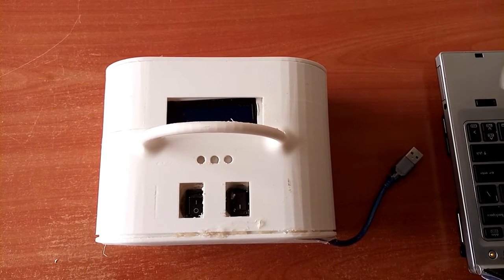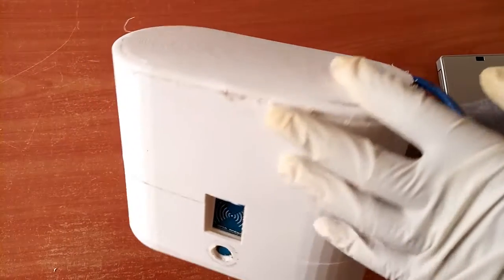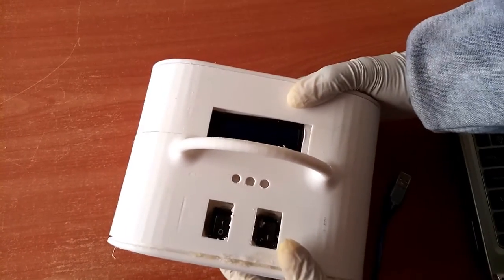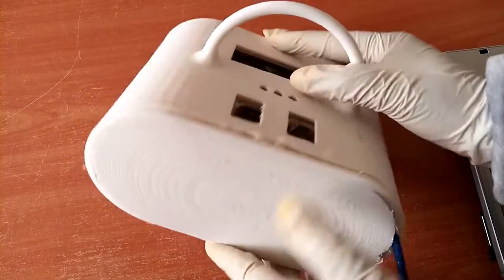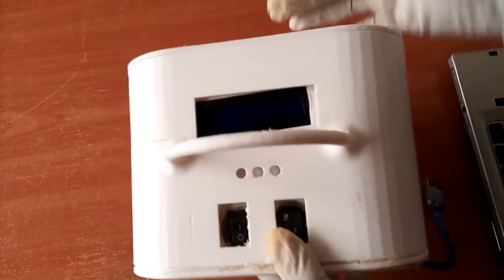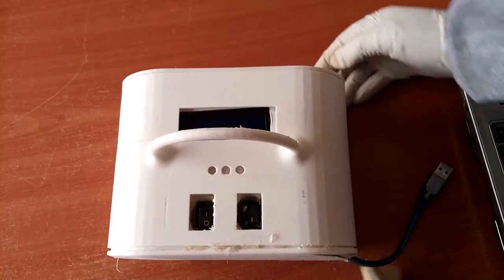These are some of the features and recommendations of the device of our project. Our device may require a power backup, and we intend to use a battery of around 12 volts. And also, we recommend to have more advanced RFID modules and metal detectors to improve its sensitivity, since we used the less sensitive modules due to the financial constraints. Also, we recommend that we have printed circuit boards so as to reduce the cost of the whole system and to replace the extensive use of the electronic components. Also, we recommend the use of a Wi-Fi module, since the Wi-Fi module should be used to improve or replace the Bluetooth module, which currently shares the information regarding the number of equipment received.